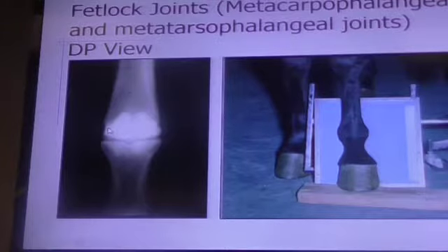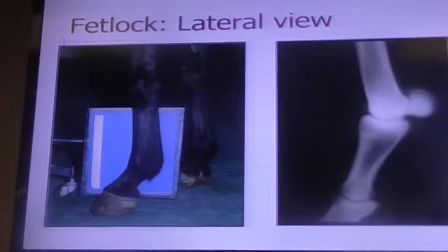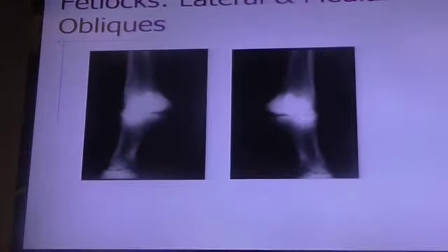Now, it varies from breed to breed, and it's different from the front limb and the hind leg. So you can't always use that. But that's something that you can start with, okay? Tall for lateral, and then fat or filling along the medial surface for medial. Okay, so that's a lateral view.